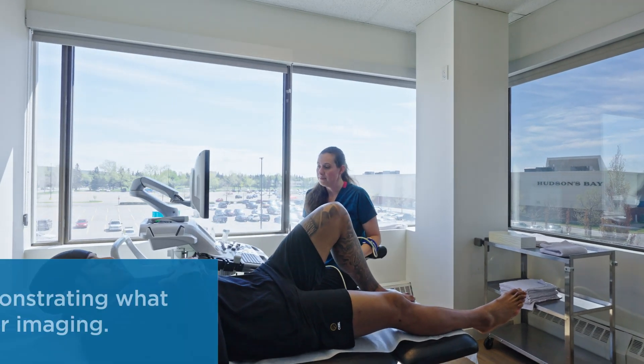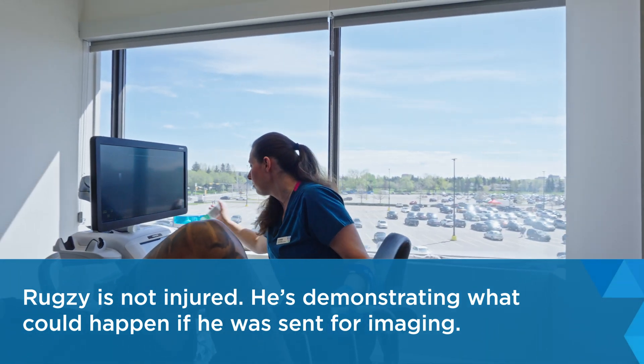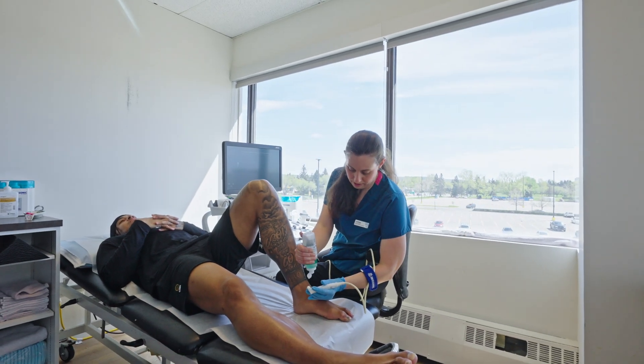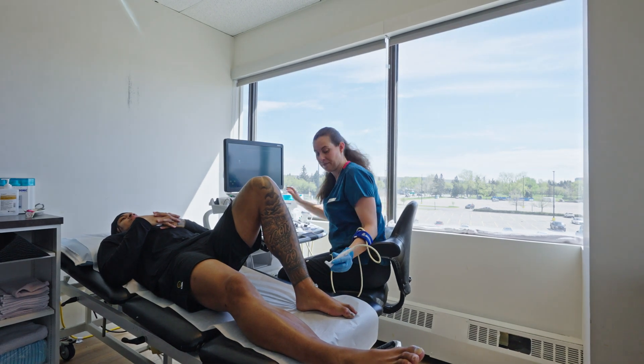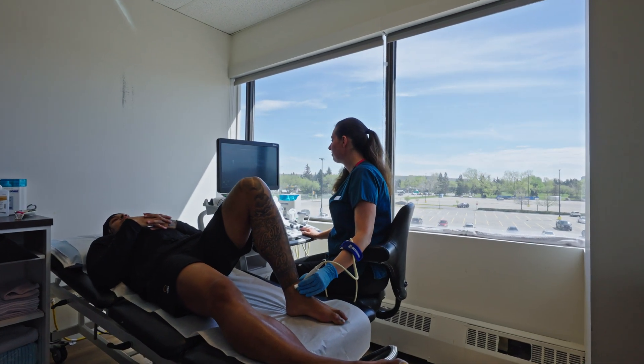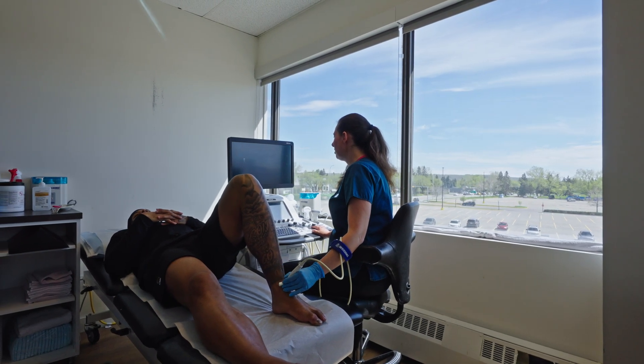Are you comfortable like that? You've got your knee bent, foot flat on the bed. I'm going to put some gel on the end of you here — it should be nice and warm. I'm just going to be going up and down on your foot and your ankle here.